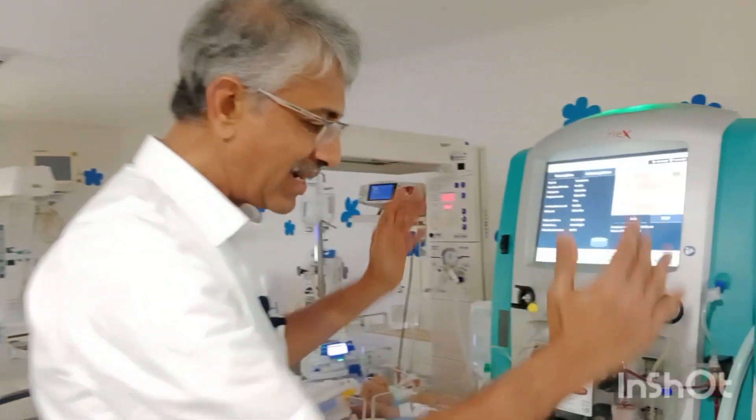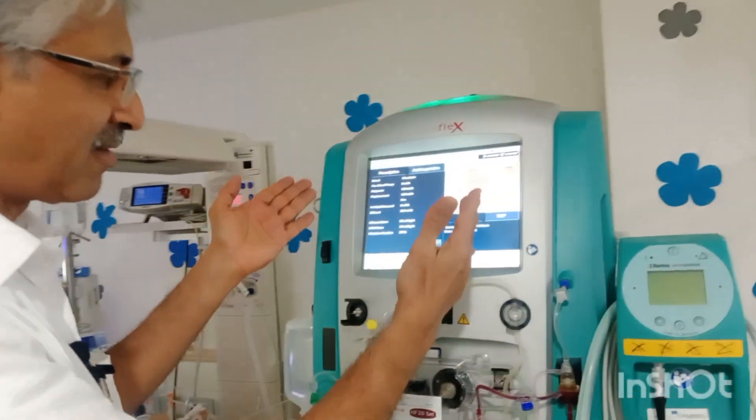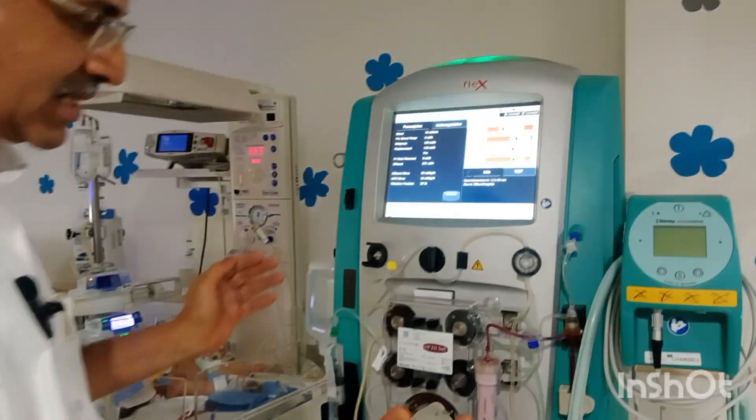Hi, I'm Dr. Venkatesh. I'm a consultant neonatologist. Today I'm going to demonstrate a dialyzer machine, Prismoflex, and this is used as a renal replacement therapy.